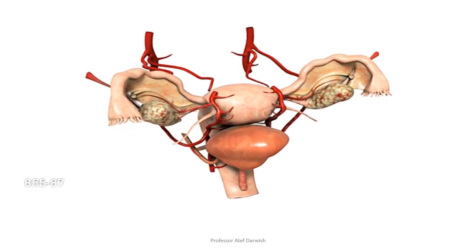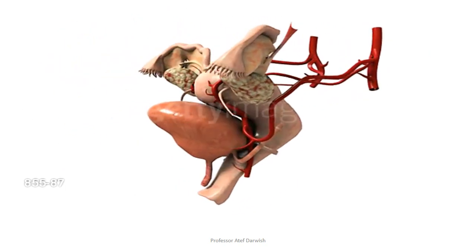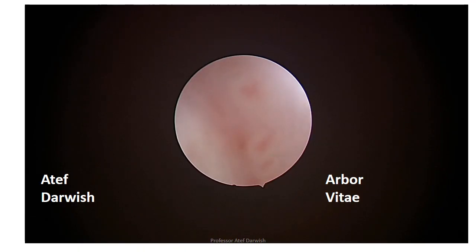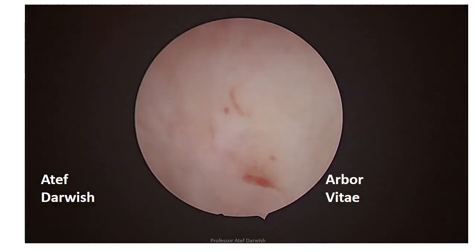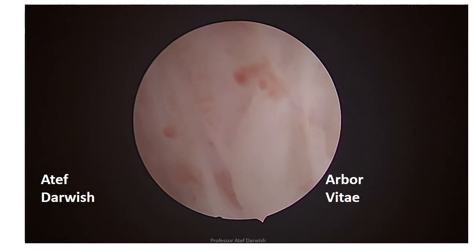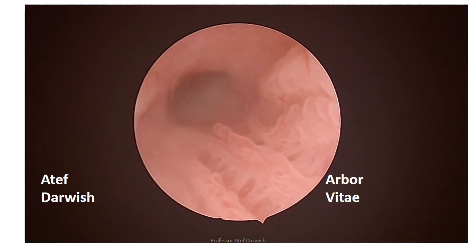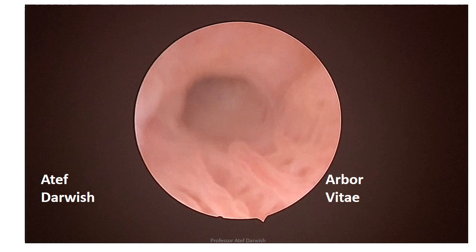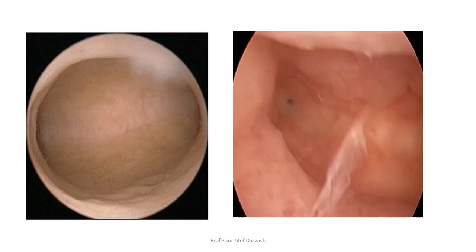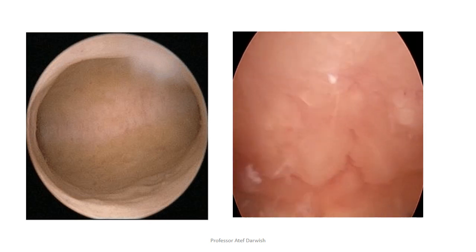We know that the best access to the fallopian tube is done via laparoscopy, as the fallopian tube is entirely seen by laparoscopic examination. But when you are doing hysteroscopy, you start by examination of the cervical canal and comment on normal findings — like the crypts seen here in this video, which are the storage place for sperms — and any abnormality inside the cervical canal should be commented on. Thereafter you go inside the endometrial cavity and comment on the internal os, the fundus, anterior and posterior uterine walls, lateral uterine walls, and cornual ends.